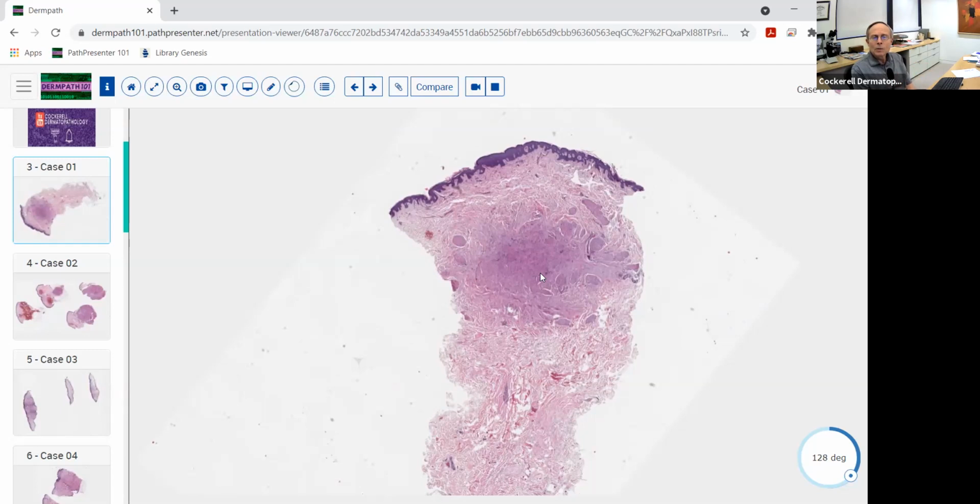And then there's a couple of others, the leiomyosarcoma, which is a malignancy of smooth muscle. And then we have the so-called atypical leiomyoma, which we'll talk about as an intermediate lesion. So this first one is an example of just a garden variety pilar leiomyoma.